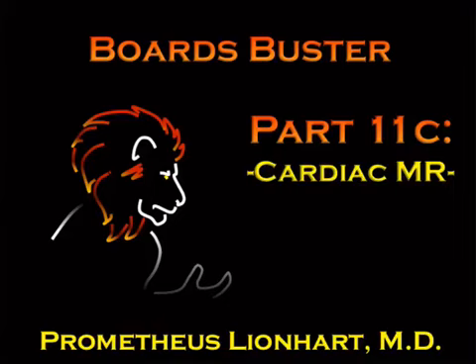Okay, so this is our cardiac MR lecture. Cardiac MR is a source of a lot of anxiety for people, especially those who have attended smaller community programs, because they may have never seen a cardiac MR or only seen a few cardiac MRs, and most of their exposure is from books and stuff, so it's really terrifying, and you're at a big disadvantage when it comes to larger programs that do a lot of cardiac MR.